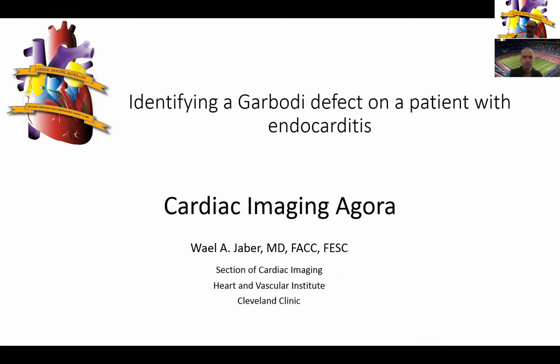On this session, this morning we will identify a Gerbode defect in a patient with endocarditis.